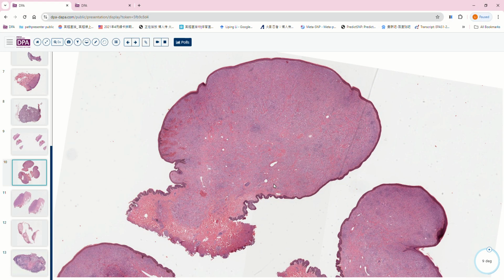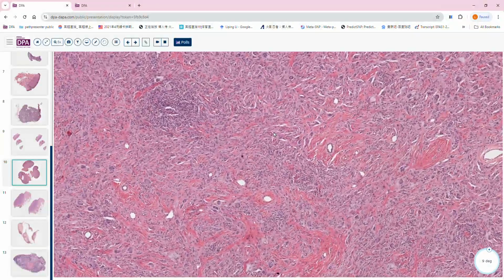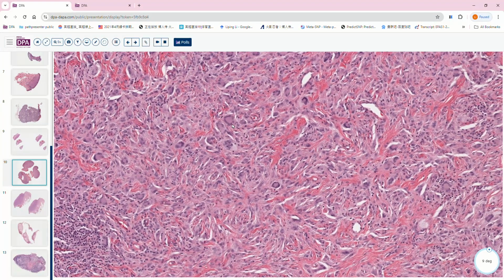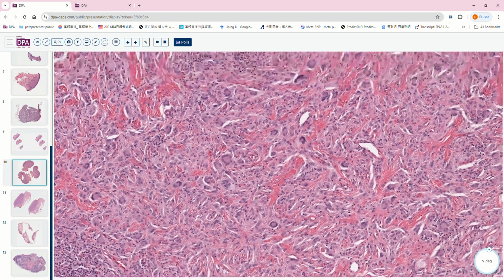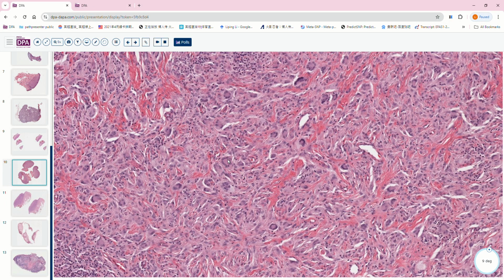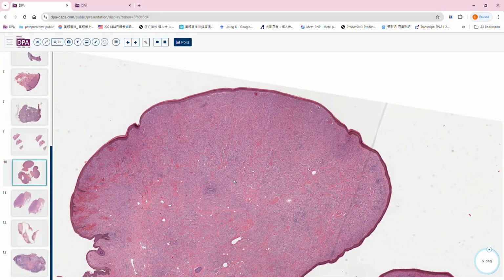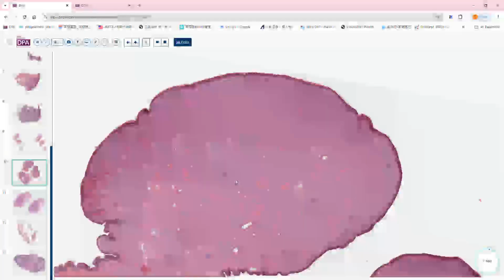Okay. Looking at the cells on my tower, I was seeing funny histiocytes. That's a good thought. Very specific giant cells. Yeah, two giant cells, a Touton giant cell. Yes, that's absolutely correct. So yes, this is JXG, especially given the history: a 15-year-old female with a neck nodule.